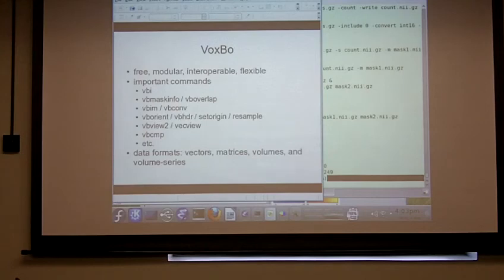And 2D files tend to have matrices, although you can also have 2D images. Often 2D images are stored as 3D volumes where the third dimension happens to have a value 1.